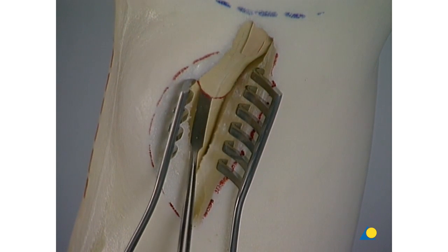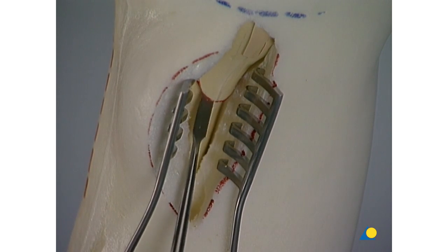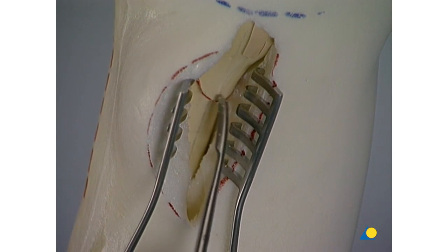After clearing the fracture gap, a reduction is achieved by pushing the medial bone block upwards.